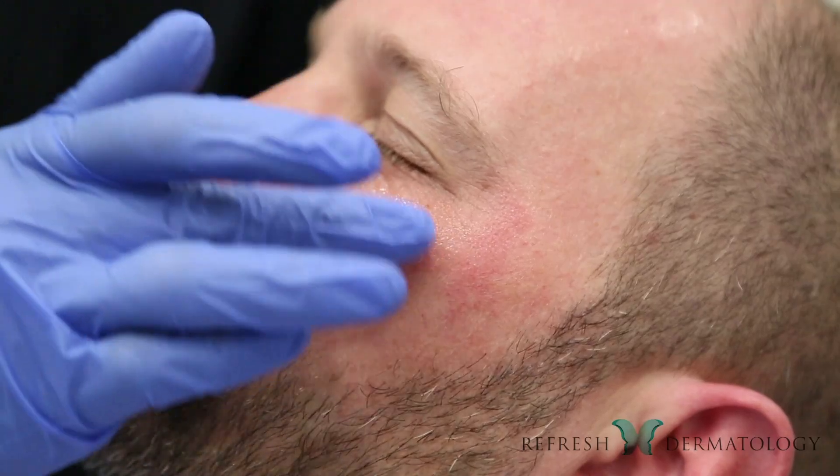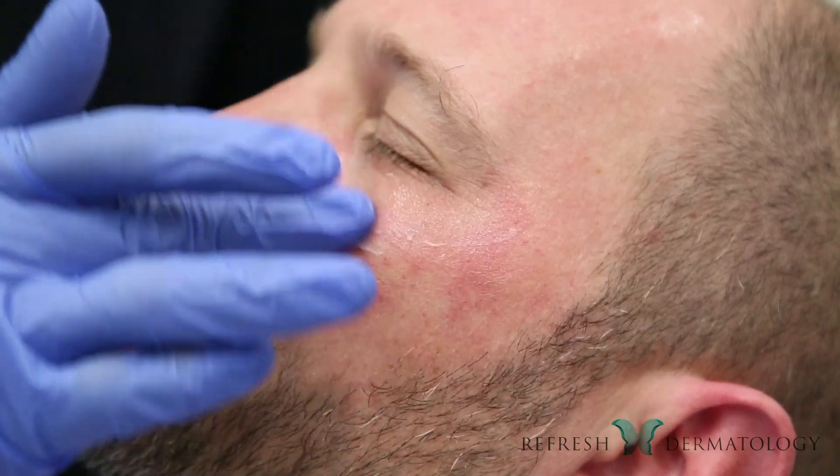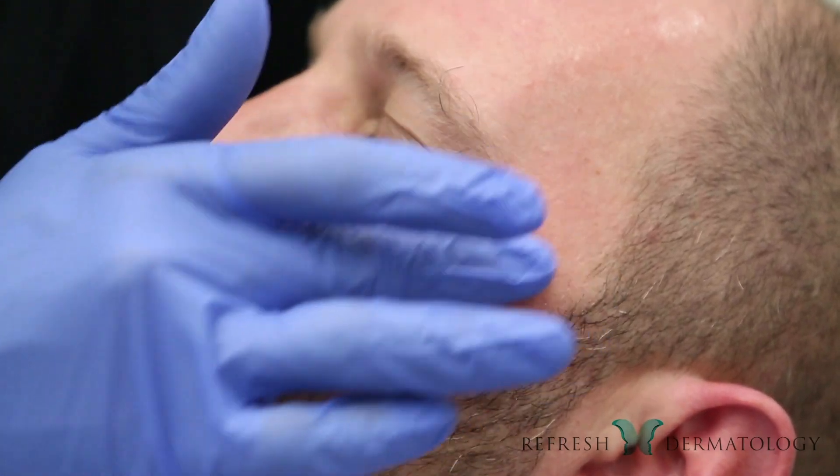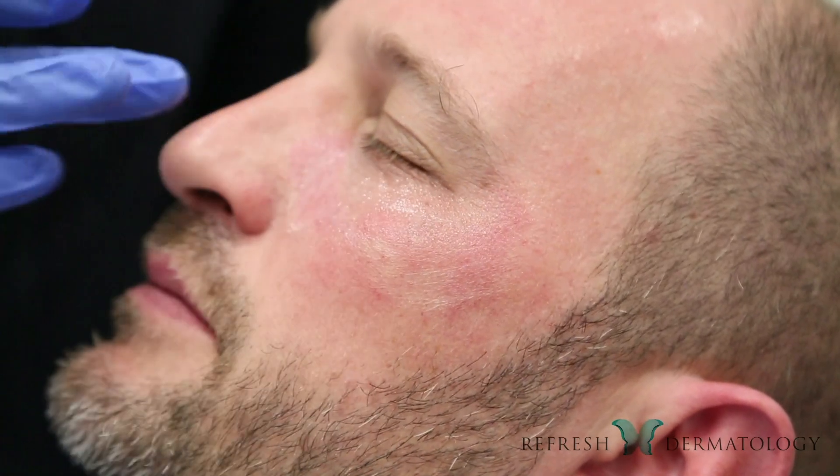After the procedure I'll feel some heat. We'll treat that with a little bit of hyaluronic acid — just a little topical serum to rehydrate the skin. Aftercare is really minimal after the under eye procedure, and I'll be good to go immediately after.